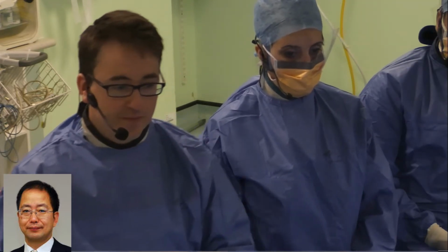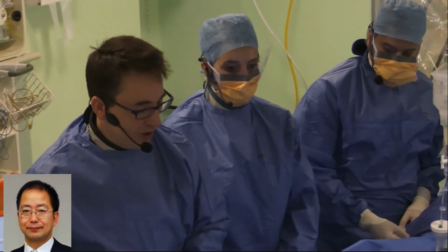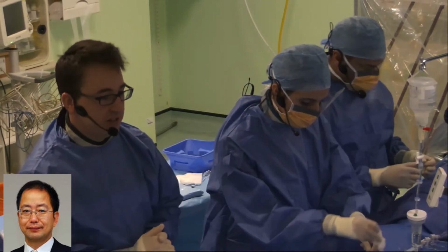Okay. Would you give me a minute for the Japanese audience? I will explain about this part. Okay. Please do. While you do that, we'll go ahead and just advance the pressure wire and just wait at the ostium prior to normalization. But you carry on, Hitoshi.